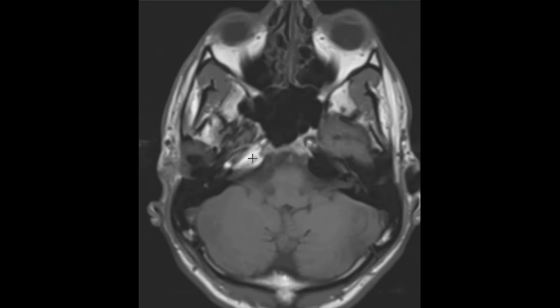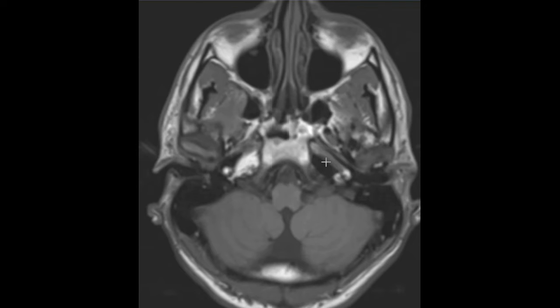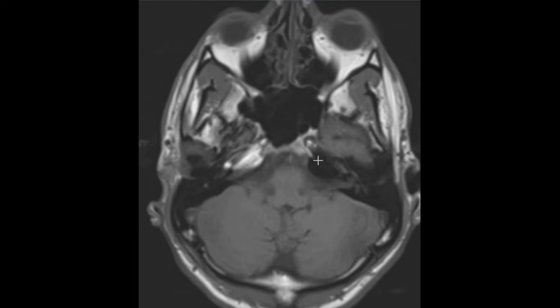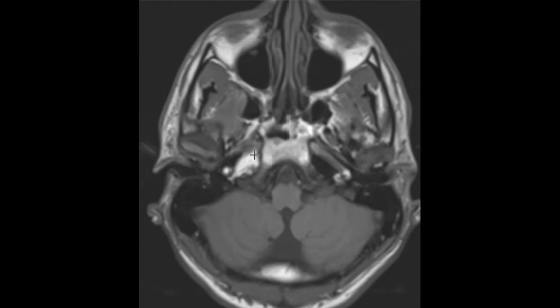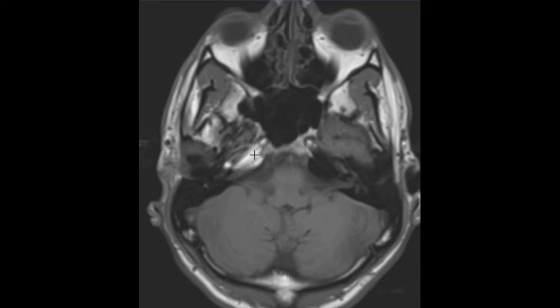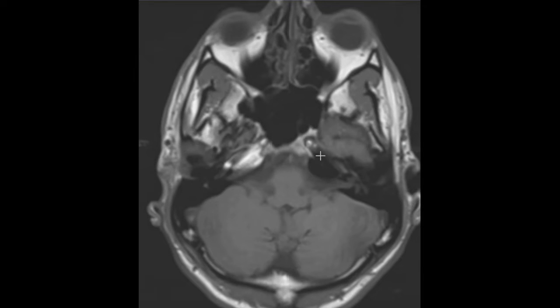Fatty marrow in the petrous portion. So we have a pneumatized petrous portion on the left and a non-pneumatized petrous portion on the right. This is pretty common, and it causes a really prominent asymmetry that catches the eye.